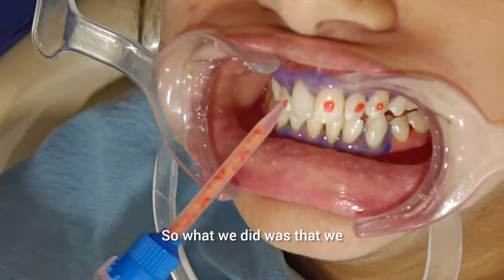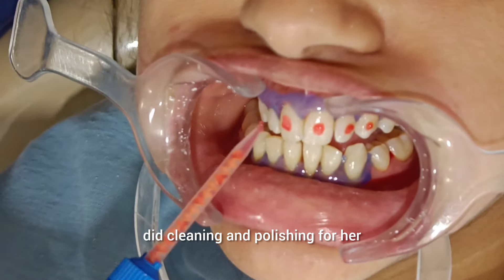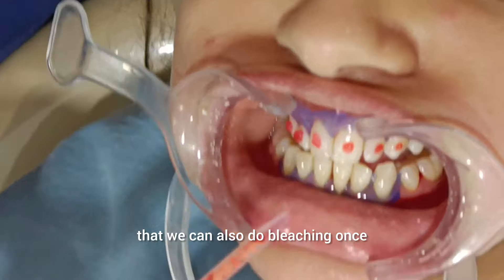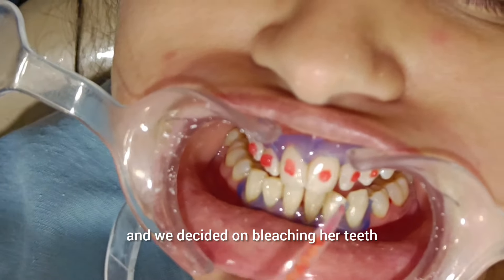So what we did was that we did cleaning and polishing for her. After that, we thought that we can do bleaching again. The patient agreed and we decided on bleaching her teeth.